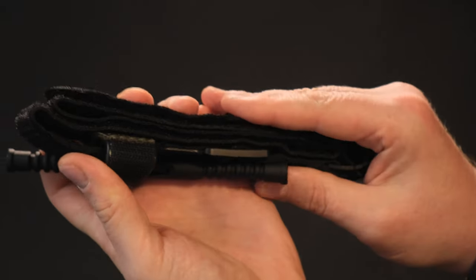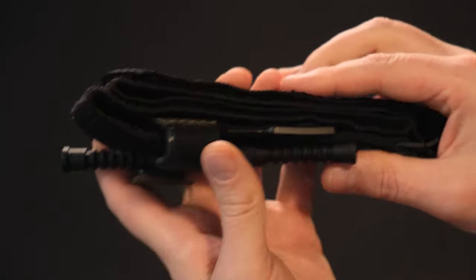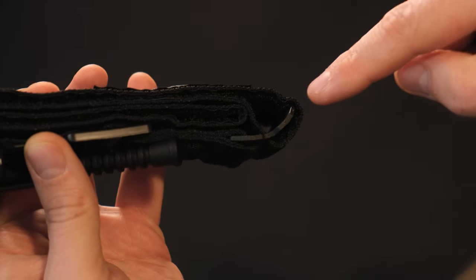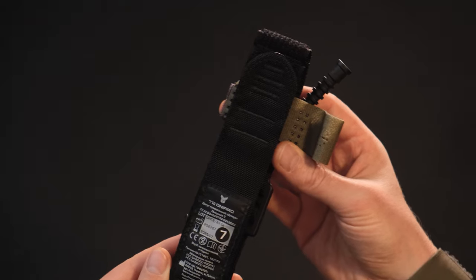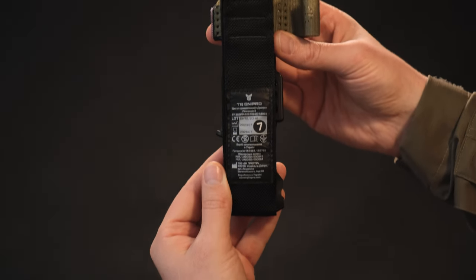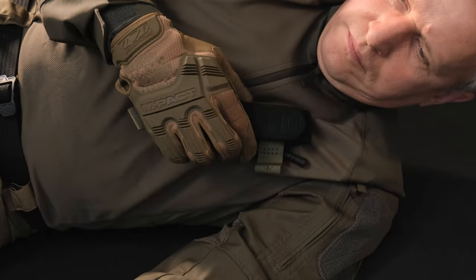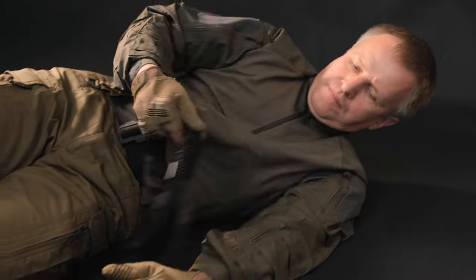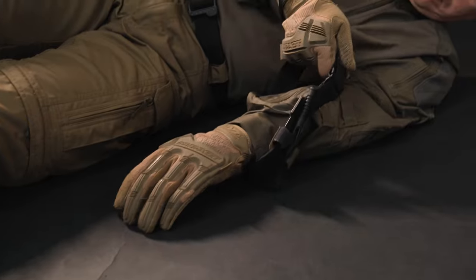Seal the folded structure — but without fanaticism. The buckle should be straightened, not bent to the inside of the tourniquet. As a result, we have the following transport position, which allows us to open the tourniquet ring with one hand either by shaking it, or, depending on the situation, by clamping it with our teeth.